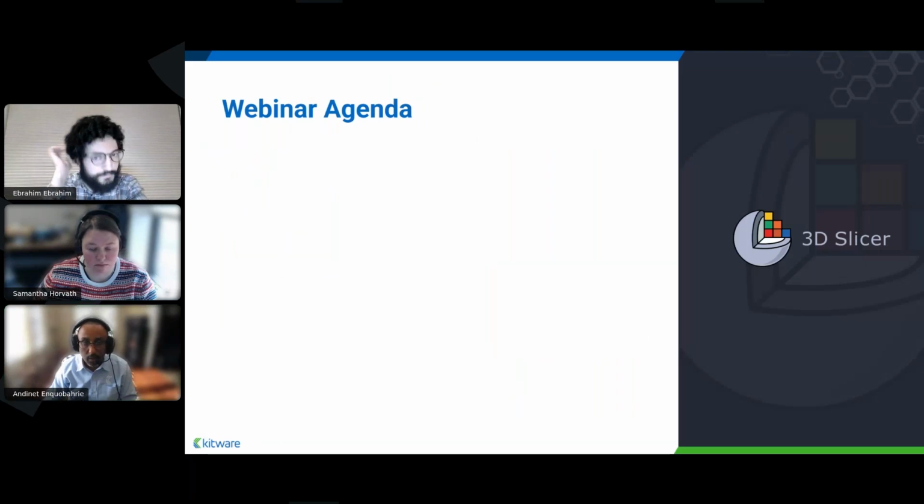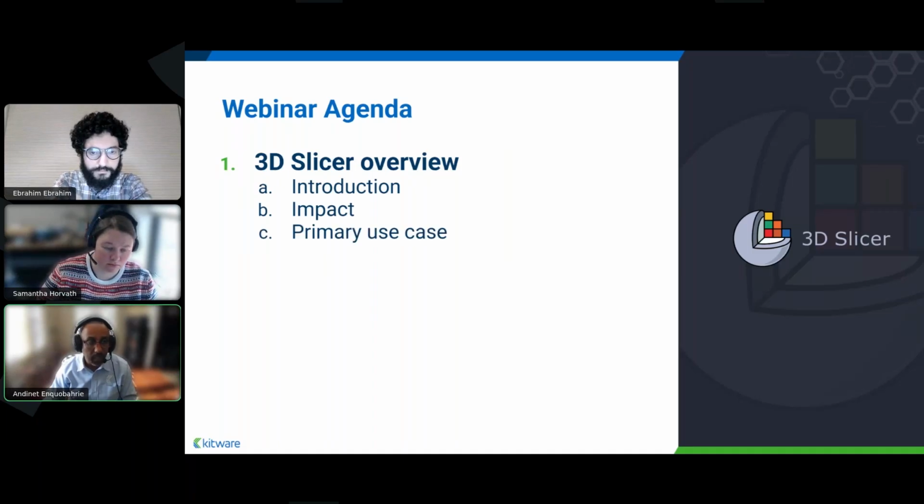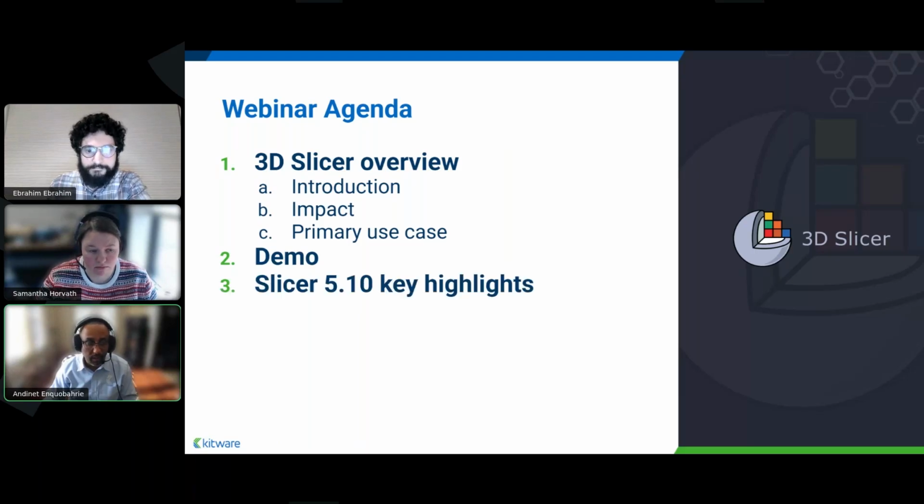In today's webinar, we'll start with a quick overview of 3D Slicer. I know there will be folks in the audience who are new to 3D Slicer, so we want to spend a little time talking about what 3D Slicer is, what its impact is, and what the primary use cases are. Then Ebrahim will take over and give a demo of all the critical new features in Slicer 5.10.